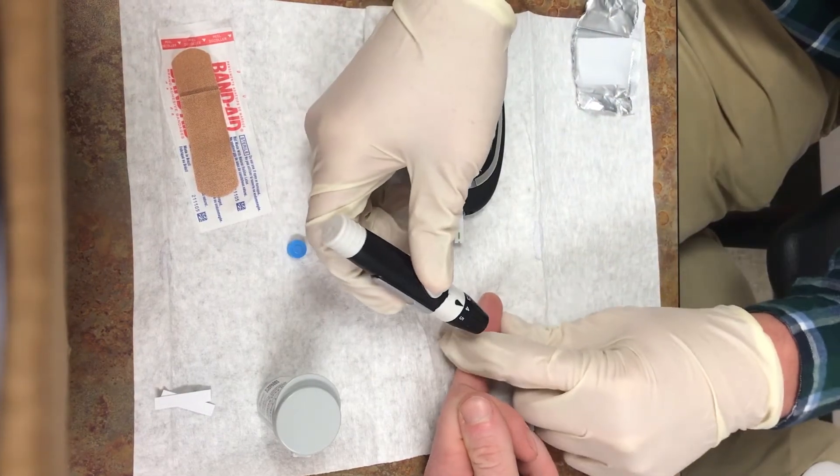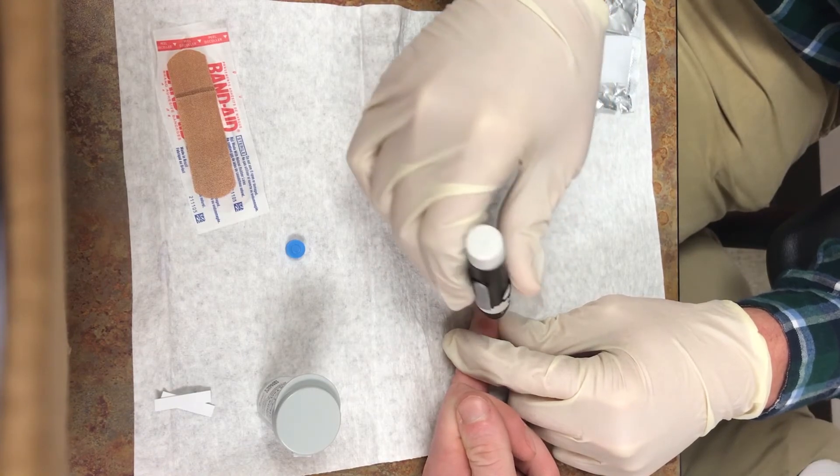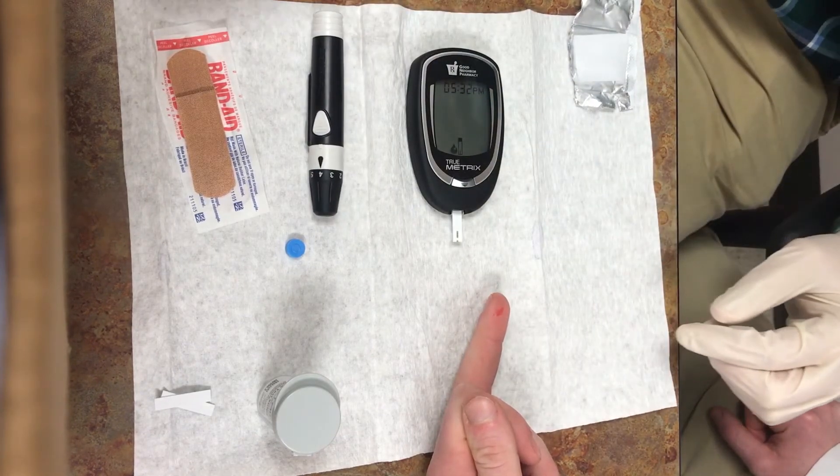Be sure when pricking the finger to prick the side of the finger rather than the pad of the finger. Now we will prick the finger using the lancet device. Place the lancet on the finger and press the release button on the lancet. This will trigger the lancet and the needle will penetrate the skin.